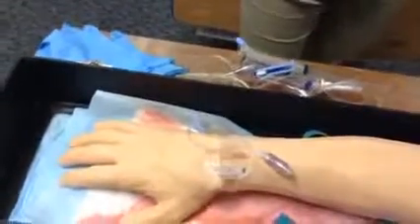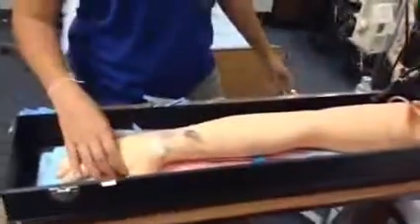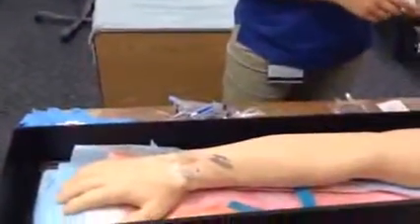The first thing we're going to do again is check the expiration date of the medication to make sure that it is not expired. It says January 2015. Then we're also going to check the doctor's orders again just to make sure that we have the right patient. Mr. Smith, can you just tell me your first name, last name, and date of birth? Alright, perfect.